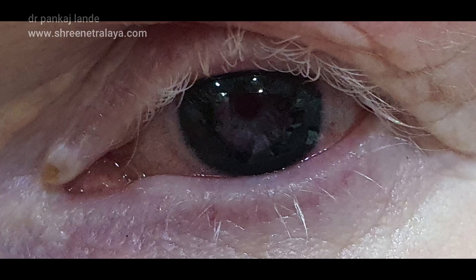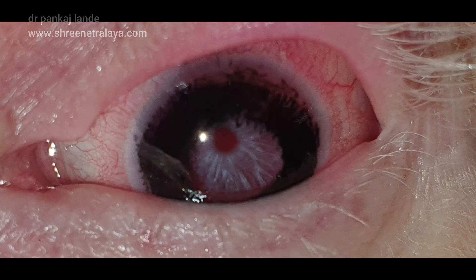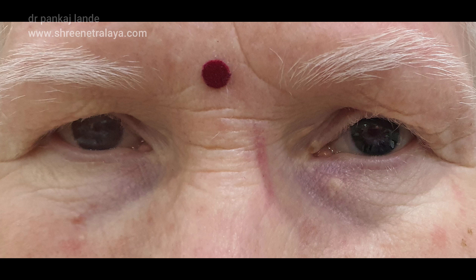These are some of the post-operative pictures of the same patient, which show an annular ring of tattoo all around. Patient vision is very good and she is quite happy with her present vision.